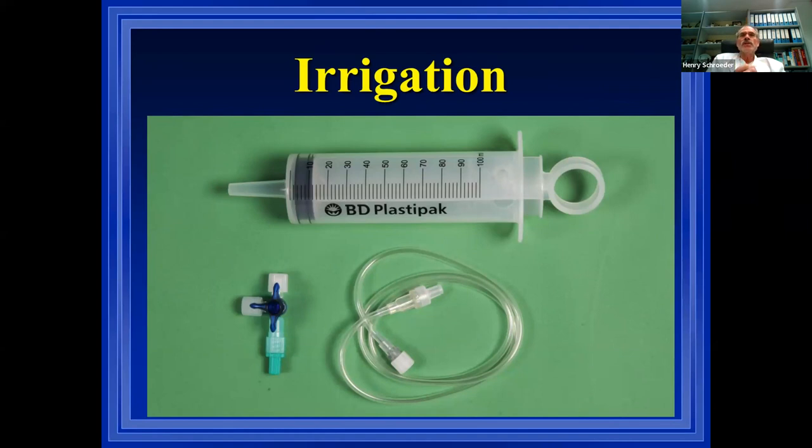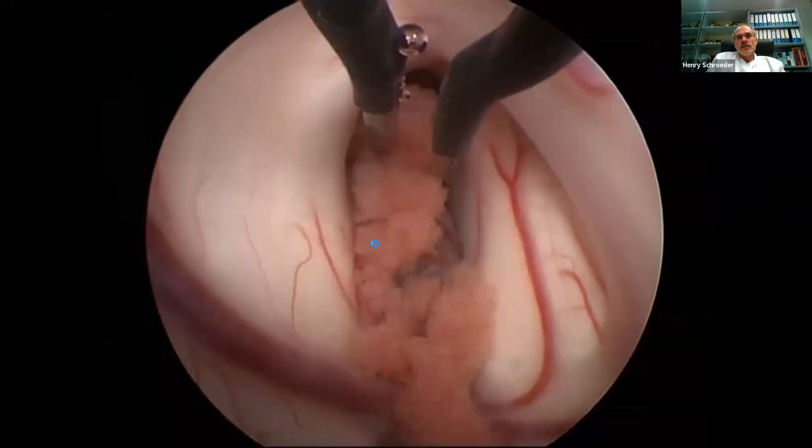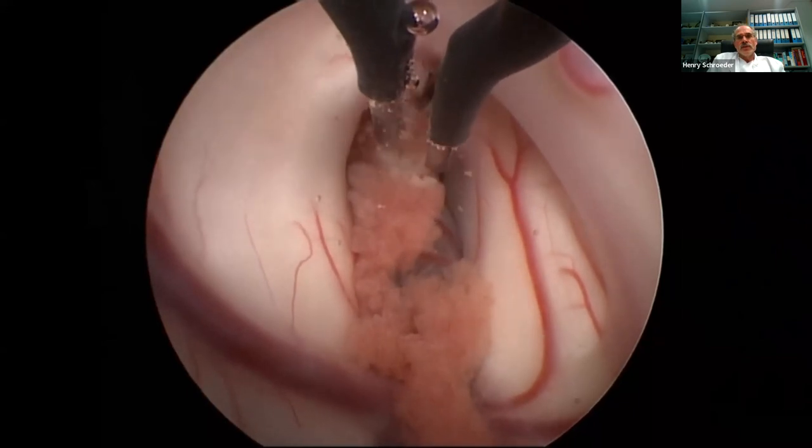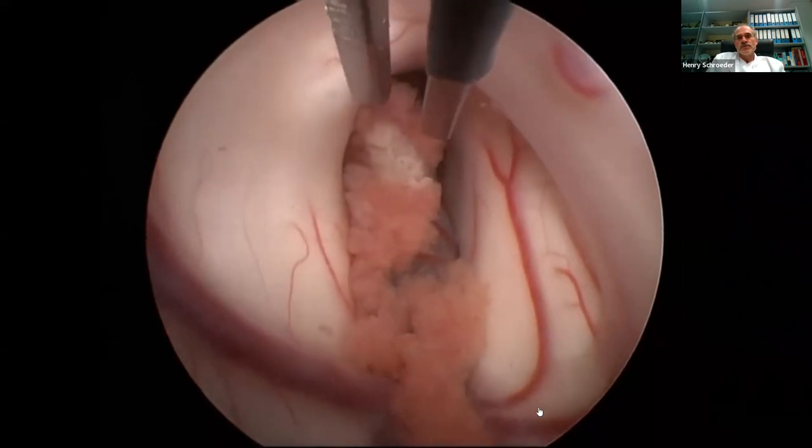It is volume and pressure regulated, but it is used for knee surgery, so it can go very far up with the pressures. You have to be very careful. It's an off-label use. We use it rarely, only if you have a surgery where you have a lot of hemorrhage. Usually we just take a syringe and rinse with Ringer solution. And this is a bipolar, but it's very effective. You can coagulate the choroid plexus or the tumor.